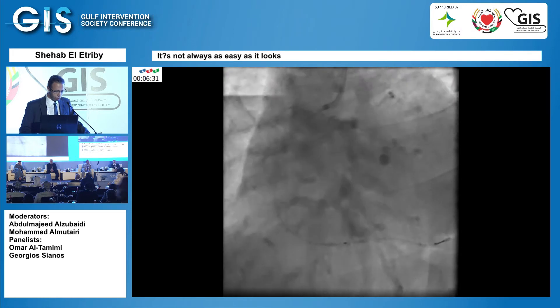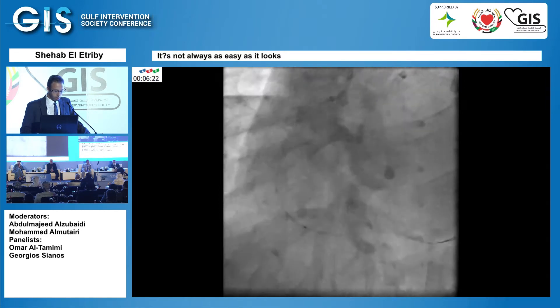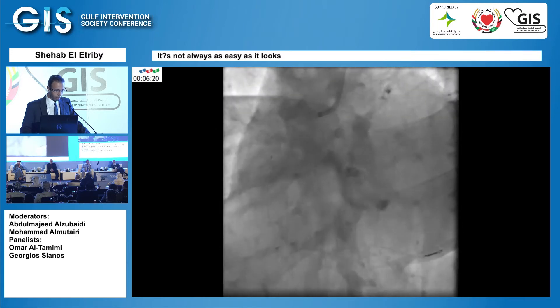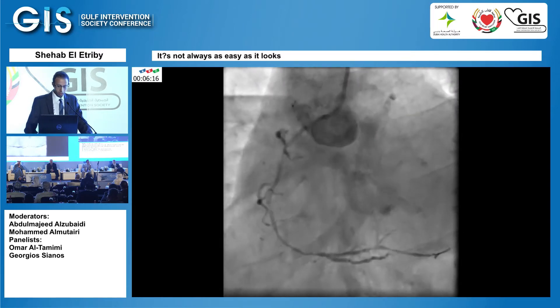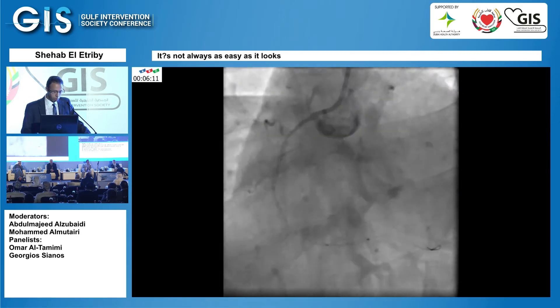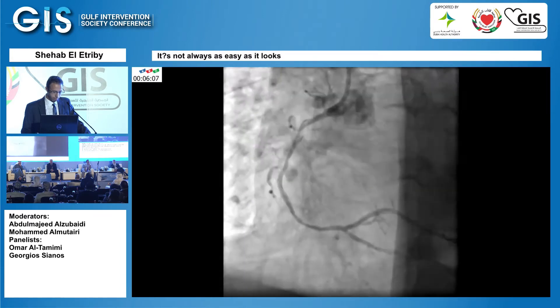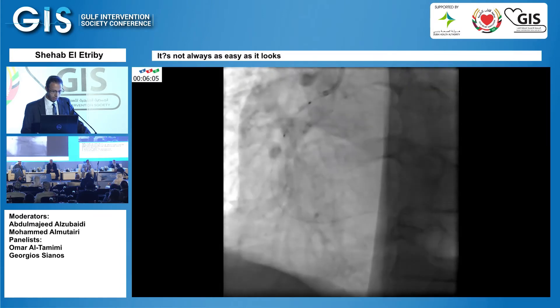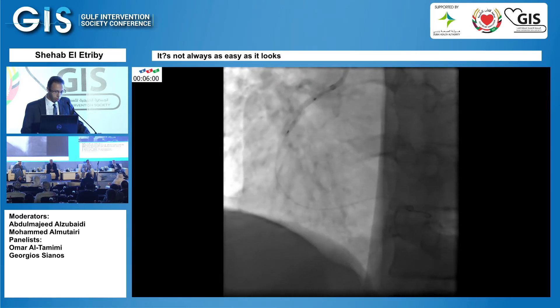Luckily, the 1.5 balloon passed. I entered with another 1.5 balloon, inflated this part, and ensured it passed smoothly. I then inflated the RCA all the way. After inflation everything looked okay, and I decided to go with the 2.5 balloon. It was a huge RCA, and this part was a bit calcific so I inflated it more with the 2.5 balloon.